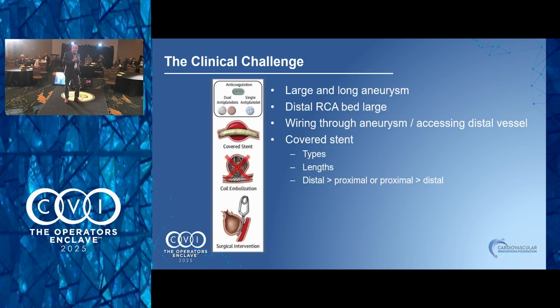Would you go distal to proximal, proximal to distal, or doesn't it matter? Probably proximal to distal, because that would make the most sense. Actually, that would be more forgiving if you lost your wire position, because then you wouldn't have to wire the distal part.